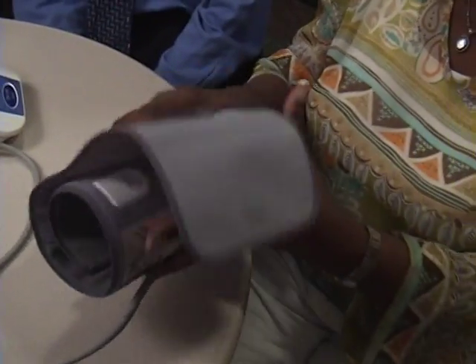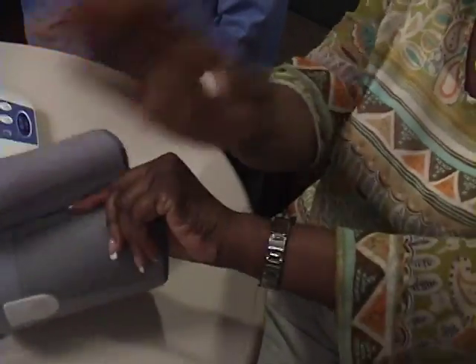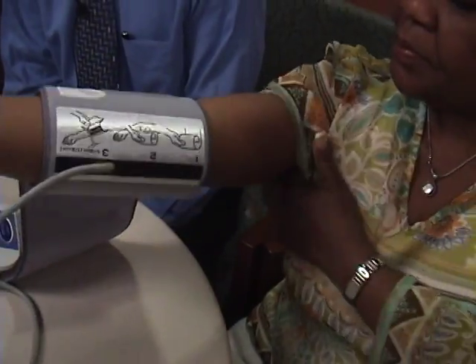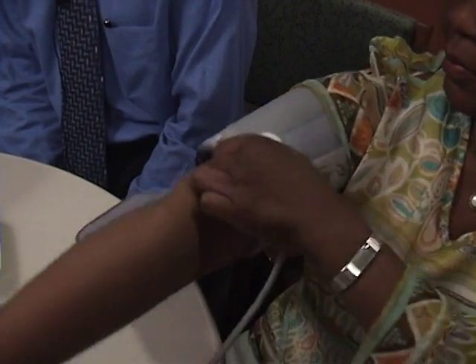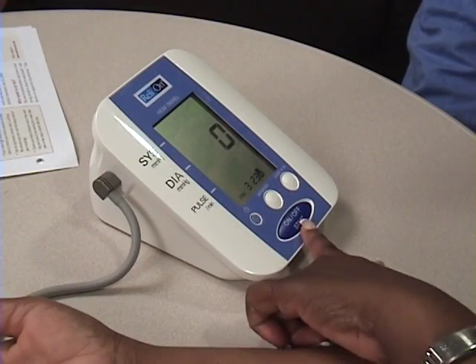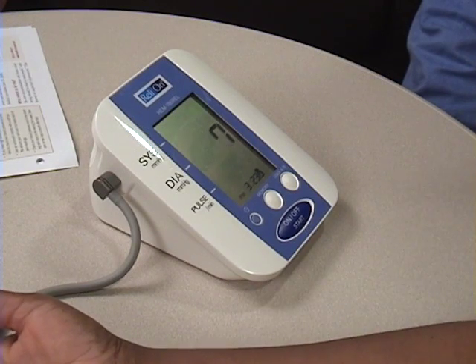First, the cuff is placed around the upper arm, with the lower edge of the cuff just about a half inch above the crook of the elbow. Once it's in place, you hit the start button, or the on button, or whatever button your machine tells you to use.